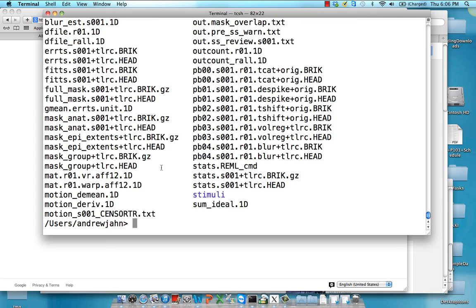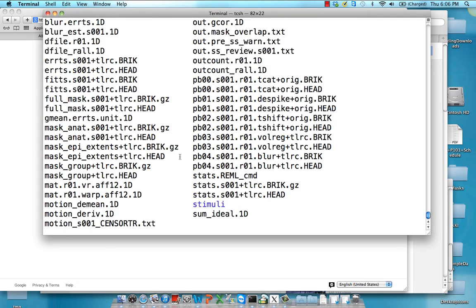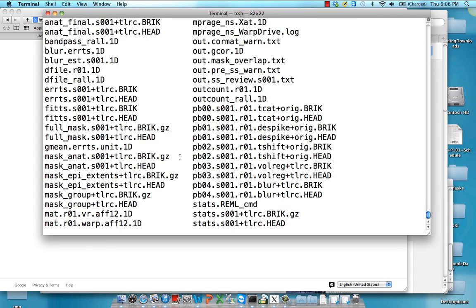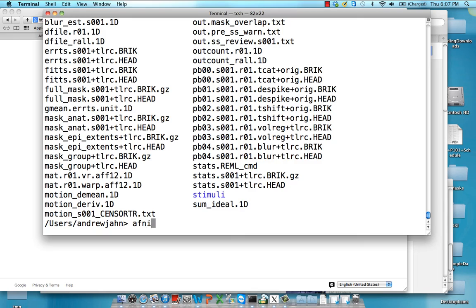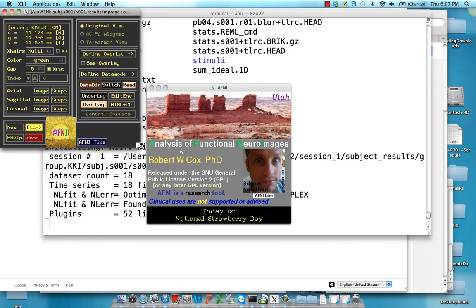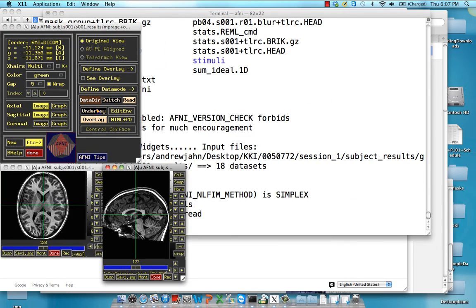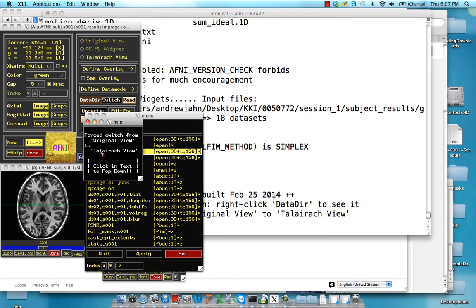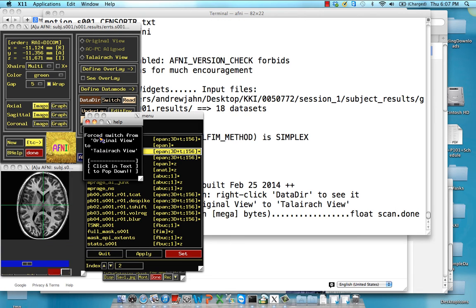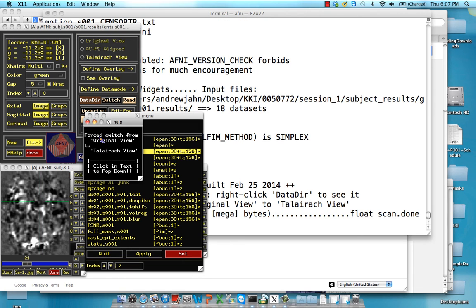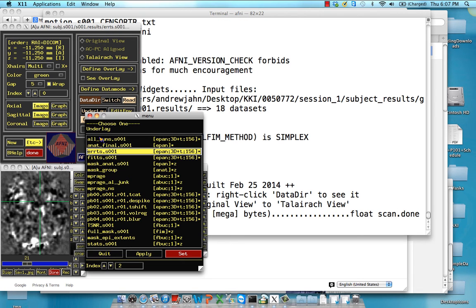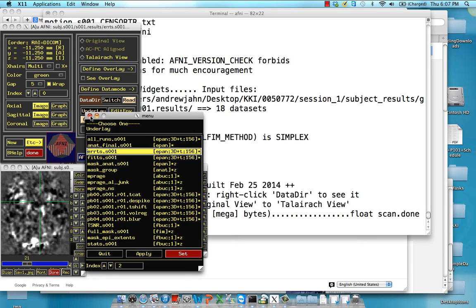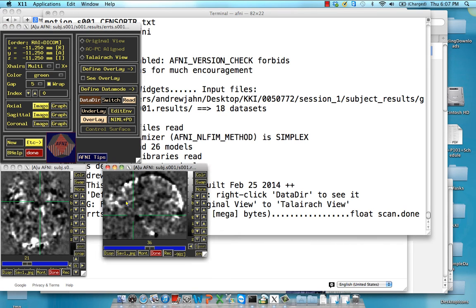So within this results, notice it's done all the preprocessing. And also, if we boot up AFNI, notice that we have this ERRTS dataset. So it's everything that we did not model, right? So all the motion stuff that gets put out into a different dataset, all the resting stuff is now going to be put out into this err.ts dataset.